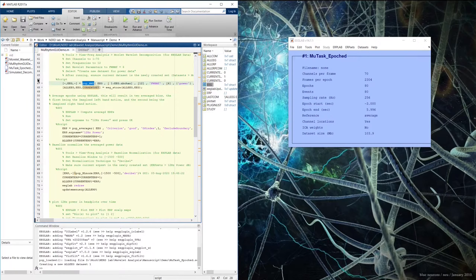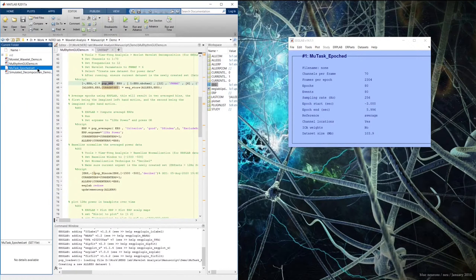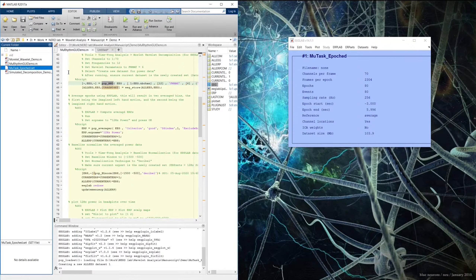I have an EEG recording of a subject performing an imagined motor movement task, in which the participant was asked to imagine moving their left or right hand in response to a left or right arrow shown on the screen — just to imagine moving their hand, not to actually make any movements. It's been shown that when a person imagines a left or right side movement, the mu rhythm of the contralateral hemisphere desynchronizes, or drops in power. The mu rhythm is the 12 Hz rhythm over sensory motor cortices, and here we're going to attempt to extract that activity in response to the imagined motor movement.